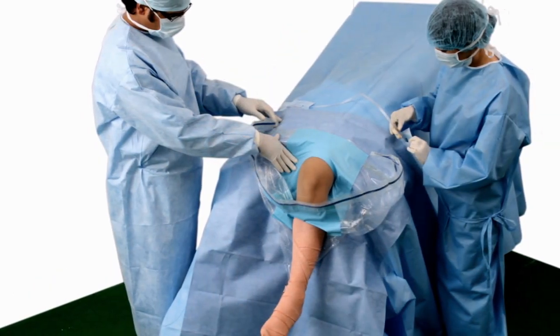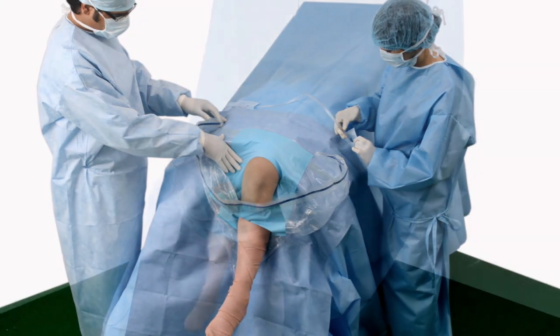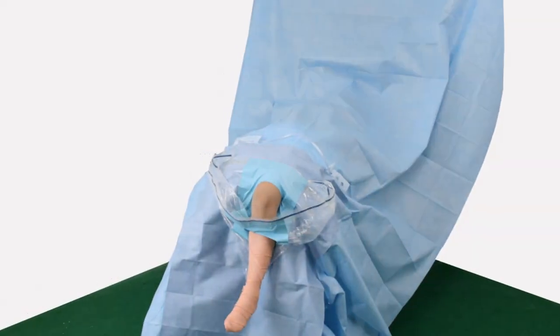Pull out pouch to extend down over knee. Customize pouch shape with adjustable wire on edge of pouch. Complete draping.